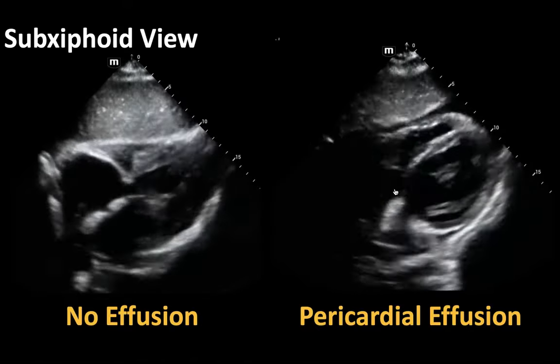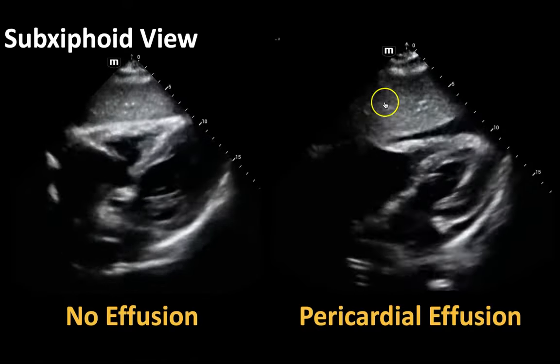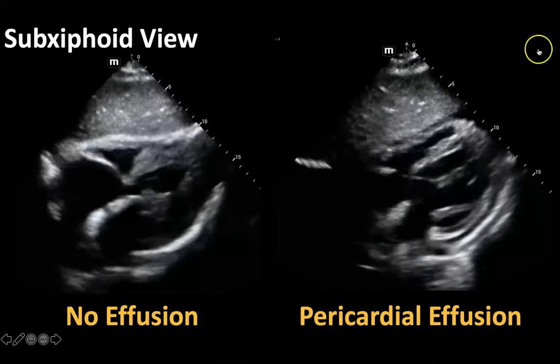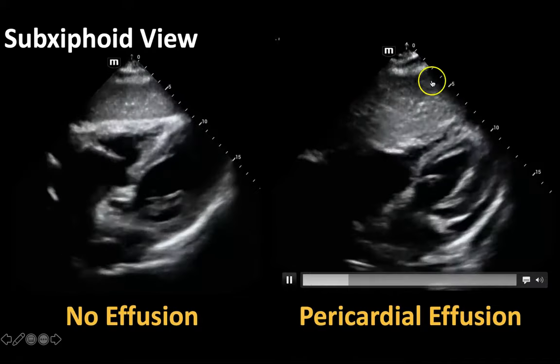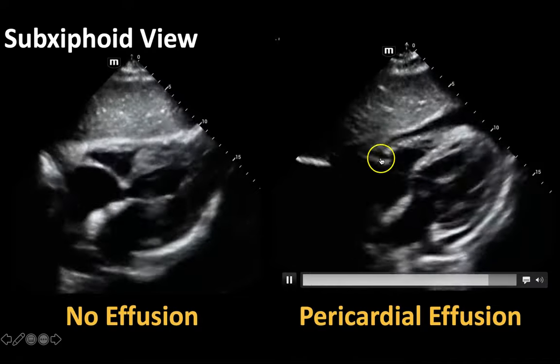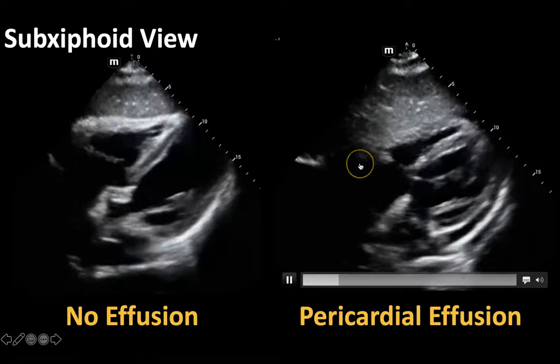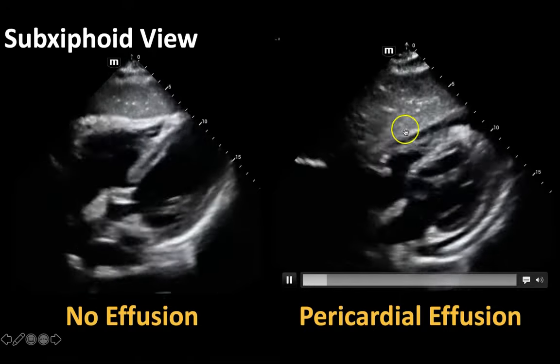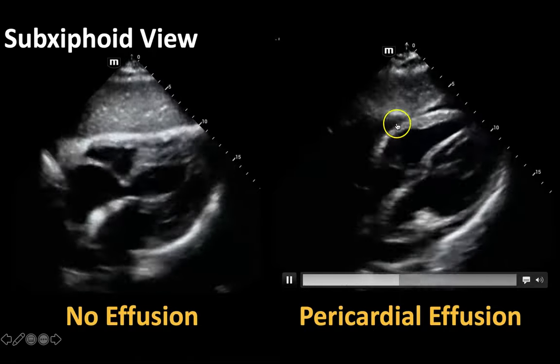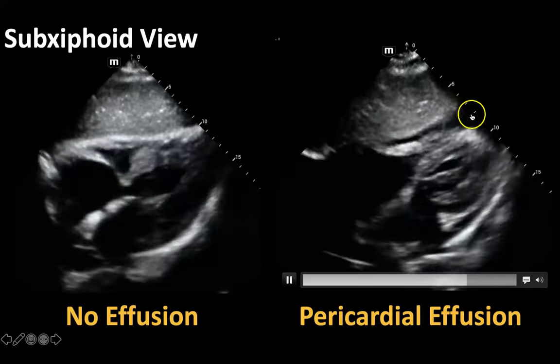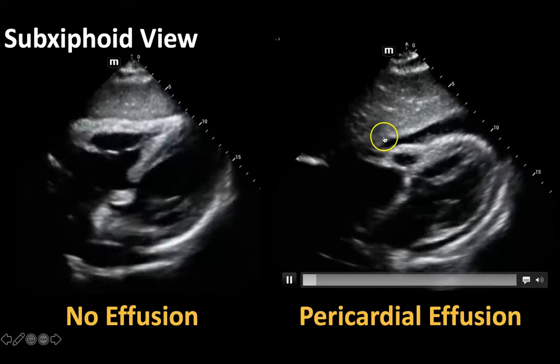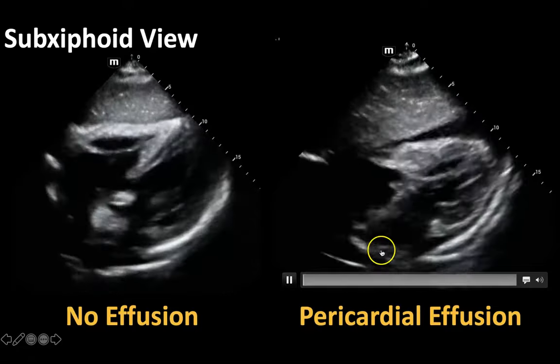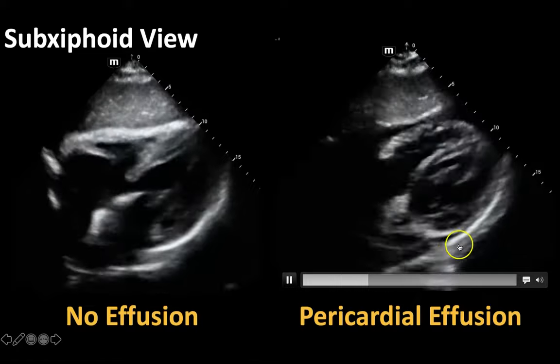Then we look at this heart on the right side of the screen — the same sub-xiphoid view. We have our liver here and then our heart here. We're training our eyes again to look around the heart in its pericardial sac, and here we do see a pericardial effusion. We see this black fluid all the way around the heart — this is circumferential pericardial effusion.